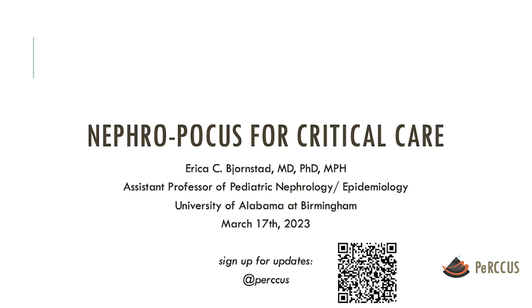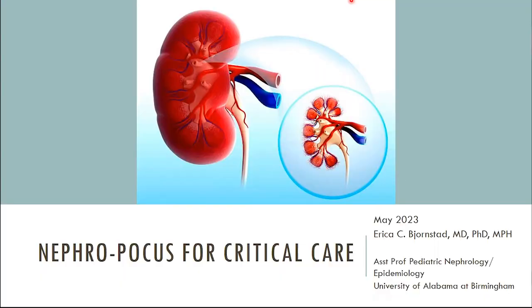So yes, as my disclaimer, I am not an intensivist by any means, but was trained in point of care ultrasound during my nephrology fellowship and have carried it over. I actually use it quite a bit when I go overseas for work, where we don't have access to good ultrasounds. But my hope here is to give you highlights of what you may use in the ICU and just the broad aspects that point of care ultrasound can be used for nephrology, as well as some references and resources you can access later.